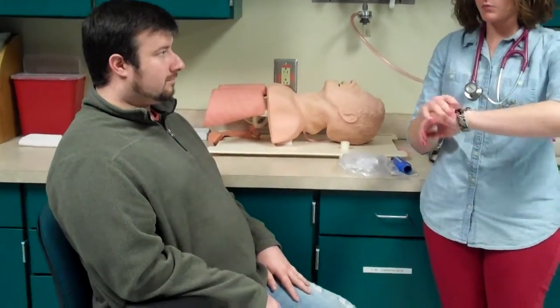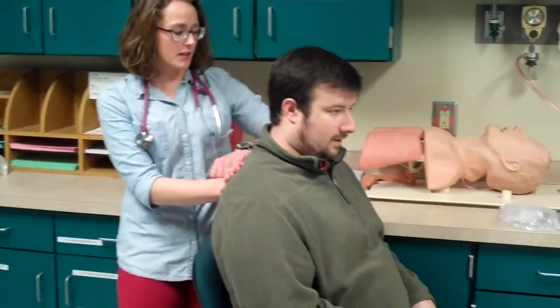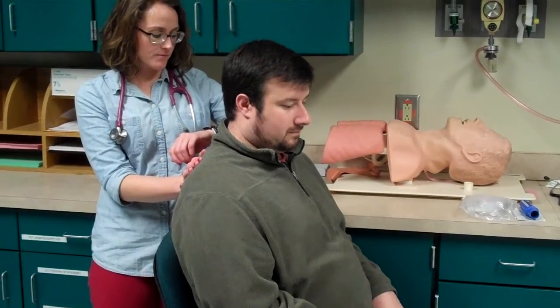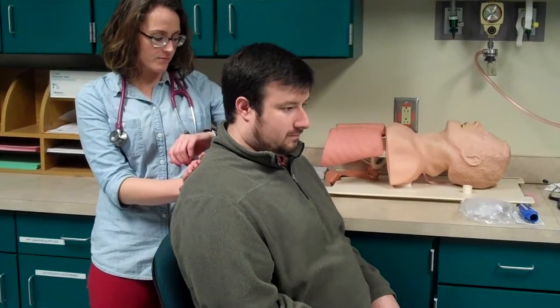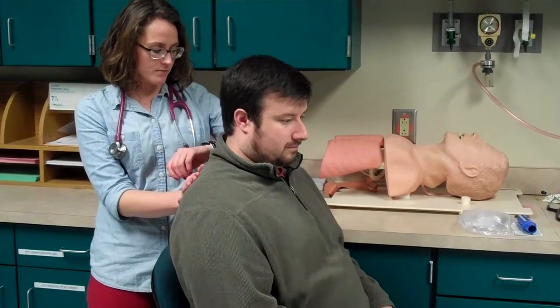And how would you measure that? Can you show me? Yep, I would. A better way to do it would be put your hand on the back and just watch in 15. And you want him to breathe what? Normally. That time it would have been 14 in a minute.